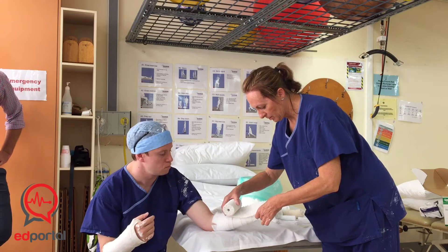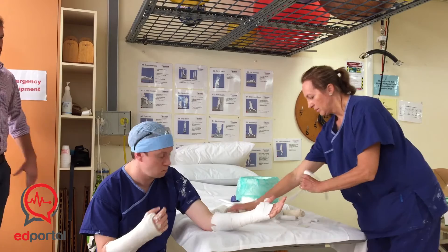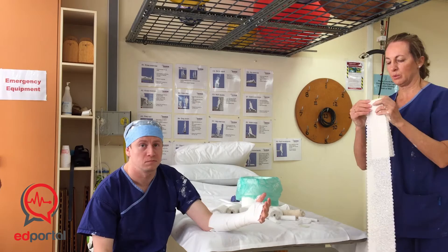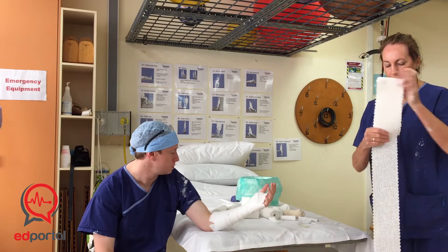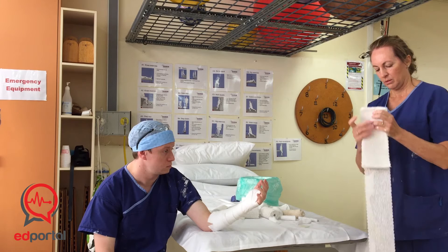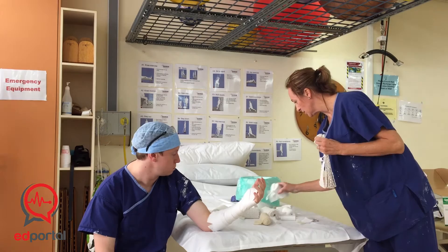So now I'm just going to measure and make the cuts, because that's going to fall back. You just drop it down like that and roll it backwards and forwards. If you roll it over and over itself, it ends up a little bit longer, so just roll it around to keep the right length. These are fairly quick to put on. Always have everything ready to go — the bandage and some tape.